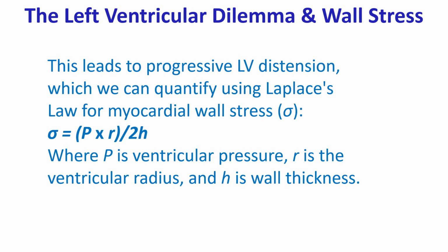This massively increases myocardial oxygen demand, defeating the goal of myocardial recovery, and can lead to stasis, thrombosis, and catastrophic pulmonary edema. This is the physiological rationale for concurrent LV unloading strategies such as Impella or IABP.